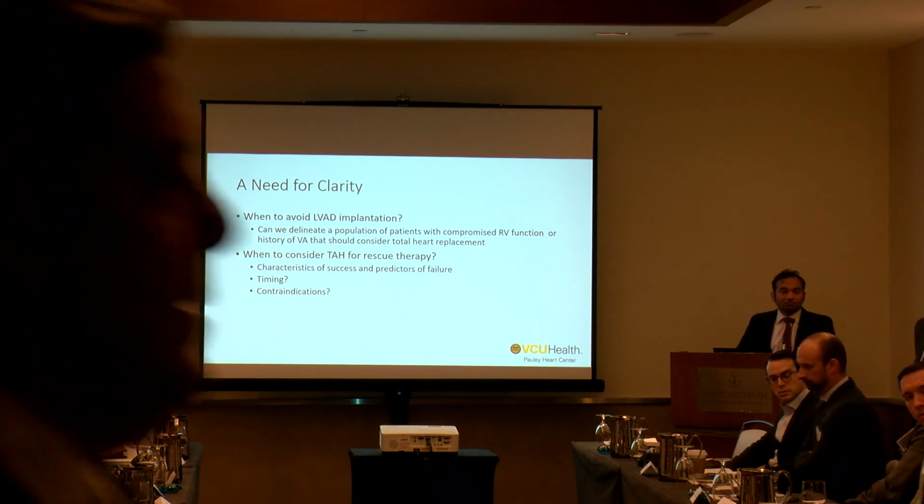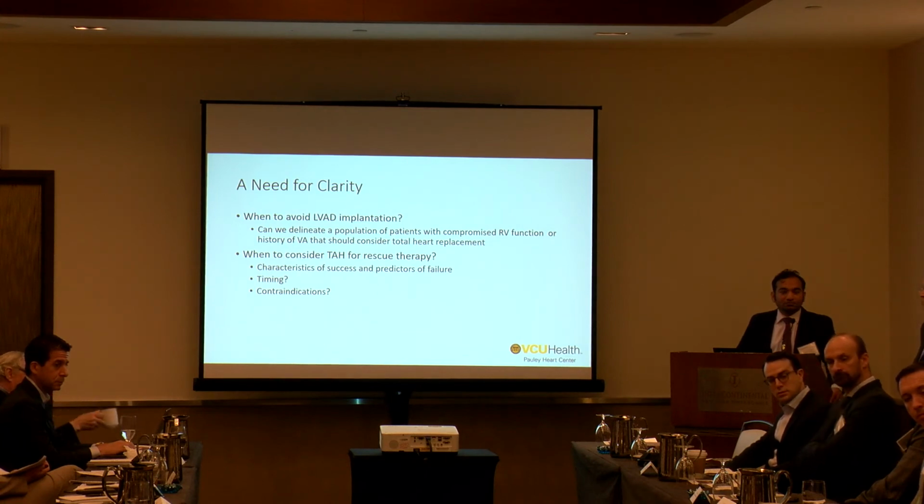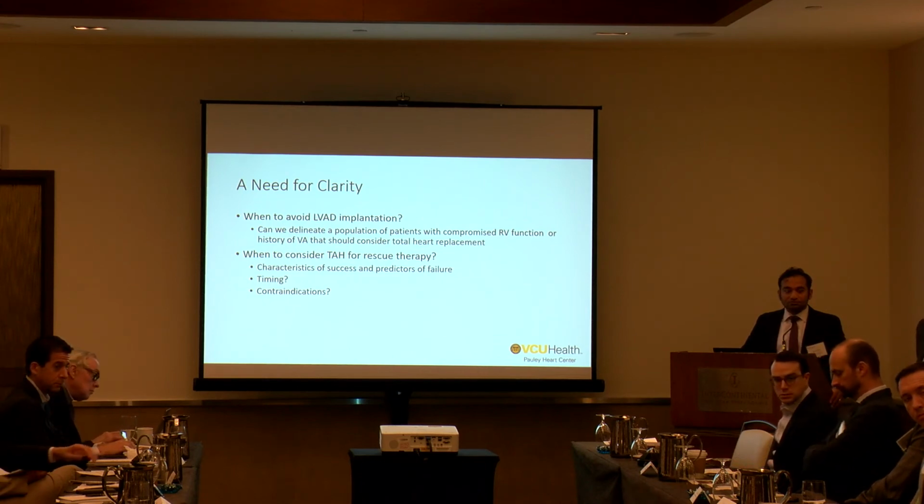Number one, do you think dialysis, someone that's on permanent dialysis, not temporary dialysis, should be a contraindication? Number two, can you comment on your experience with patients on ECMO that come in to your center? Do you ever put a SynCardia in a patient on ECMO support? Because I've done it before.